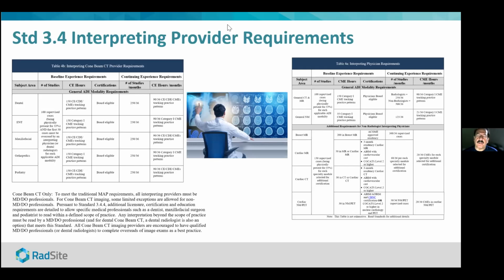If there has not been a report generated, they can look at those studies retrospectively and find somebody who would either be a dental practitioner who has this level of experience themselves, or a radiologist, somebody with the expertise and experience. That's who would need to overread those first 50 cases. It doesn't have to be prospective new cases. They can take cases that have already been done.